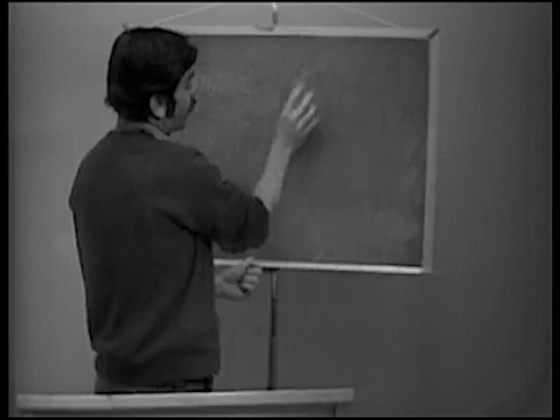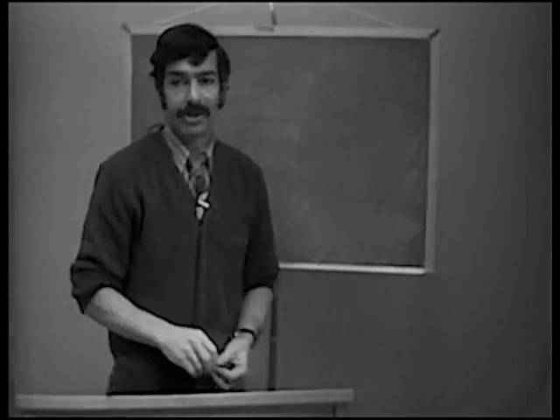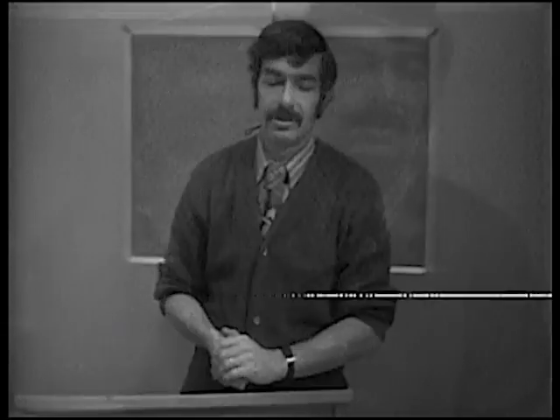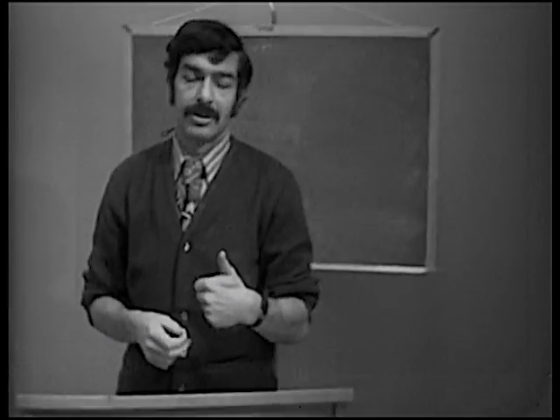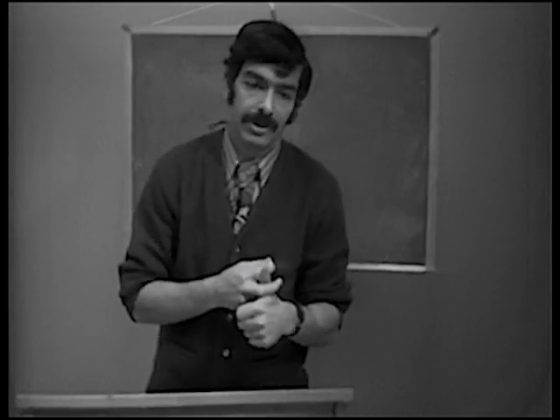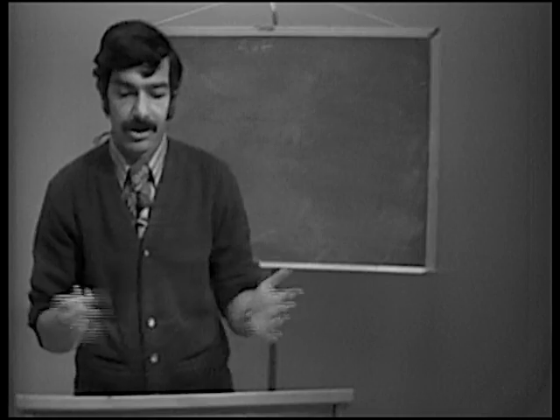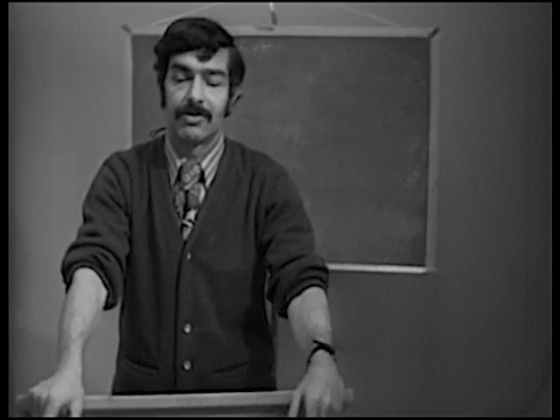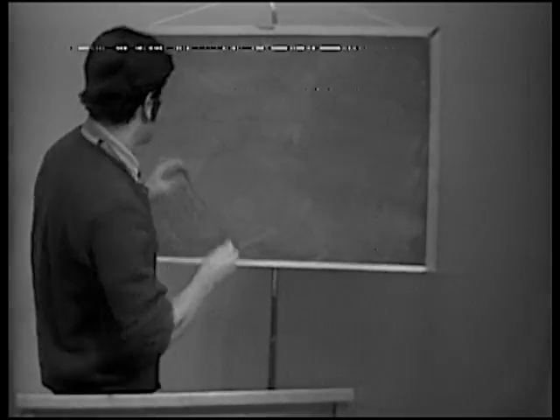Okay, now next let's go over ventricular hypertrophy. And the first thing we'll talk about is LVH. Okay, so what are the criteria for left ventricular hypertrophy? Okay, the first criteria we want to think about are voltage criteria, right? We should go by this outline. Usually when I ask people what are the criteria for LVH, all of a sudden they start listing me some numbers, voltage criteria, things like that. But the best thing to keep in mind is this outline that we're going to make.